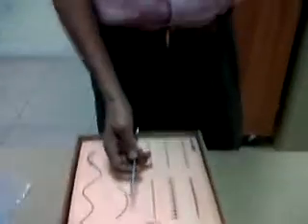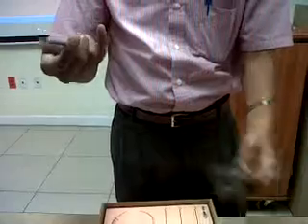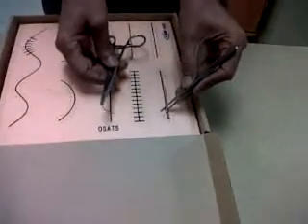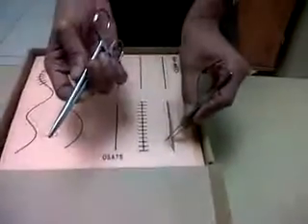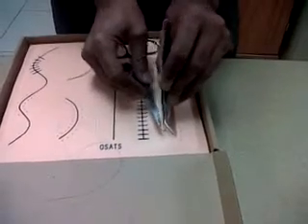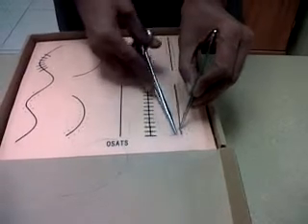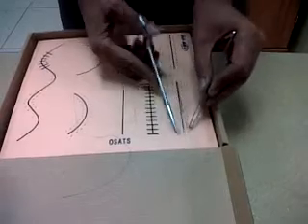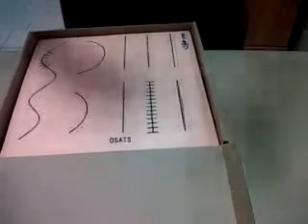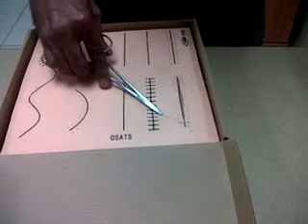Since we are dealing with the skin here, we are using a toothed thumb forcep and a cutting needle. This is nylon or polypropylene, which is a synthetic material. Let's demonstrate first a simple suture. We have already held the needle in our needle holder. We go approximately half a centimeter away from the skin edge, pick up the whole skin with the tooth forcep, take a full thickness bite without taking the needle out, pick up the other end, and take a full thickness bite and push it in a curved direction.